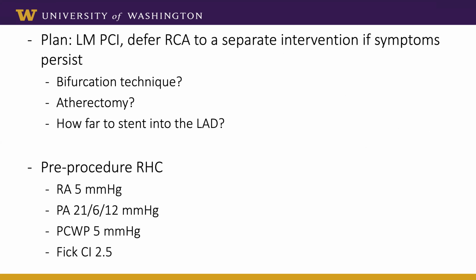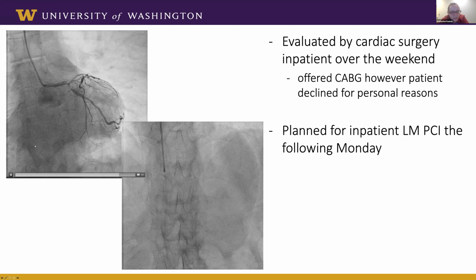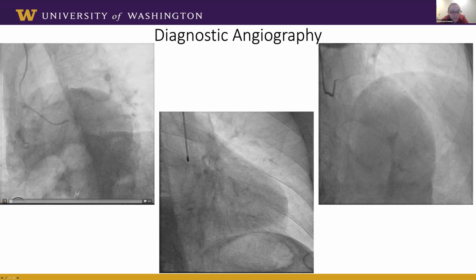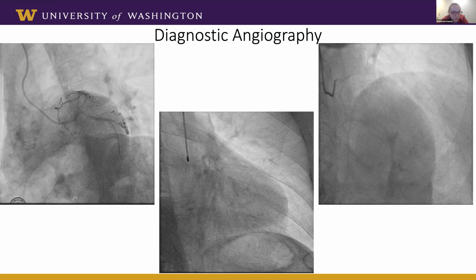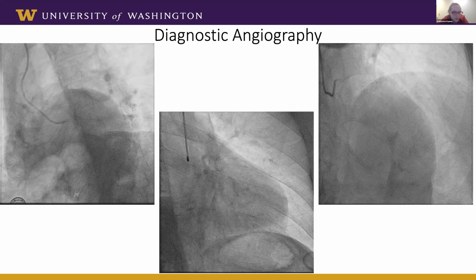I guess the other thing that jumped out at me on the angiogram is that with the distal left main stenting, it's a very wide angle. Thinking about a culotte or a DK crush, it's almost a retroflex circ when you look at the angle from the LAD to the circ in the spider. We generally wouldn't do a TAP in a left main, stenting from the left main into the LAD and doing a TAP with the circ, because it's a very wide, 120-degree angle.